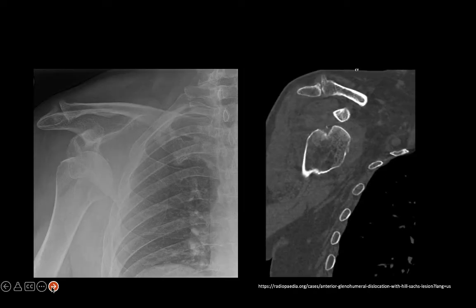All right, now here's a patient who has a very classic shoulder injury, and I'll remind you about different shoulder injuries. So the two kind of important joints in the shoulder are the acromioclavicular and the glenohumeral articulation. In this case, the glenohumeral articulation is misaligned. Now, when we think about alignment of the AC joint, we always look at the undersurface of the AC joint because sometimes the clavicle's taller than the acromion. In this case, the patient's got osteophytes growing, so we always look at the undersurface. The alignment of the acromioclavicular joint here is normal.